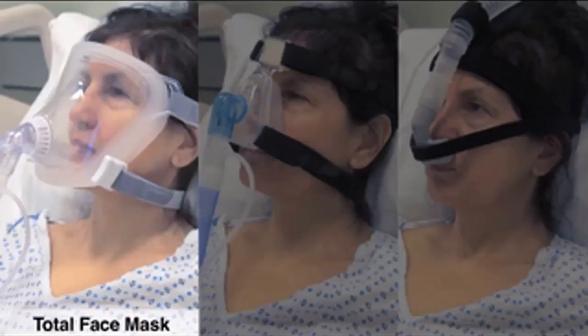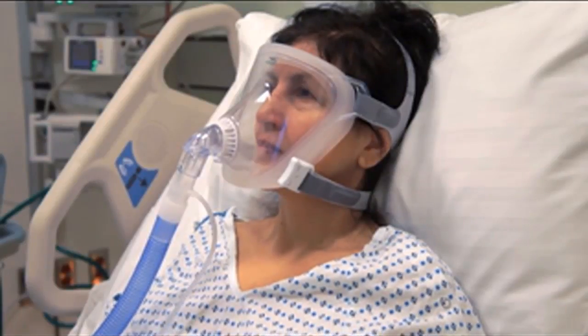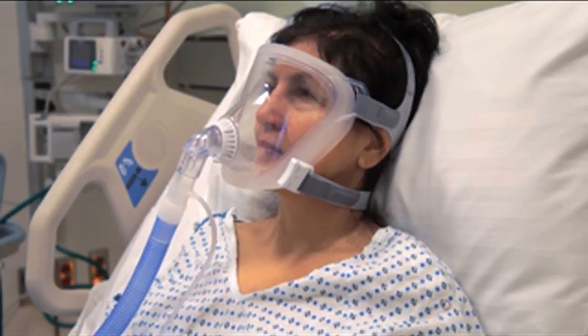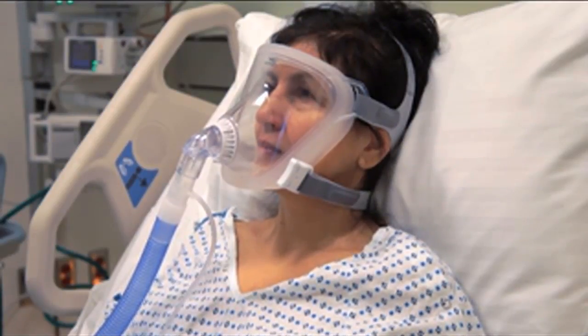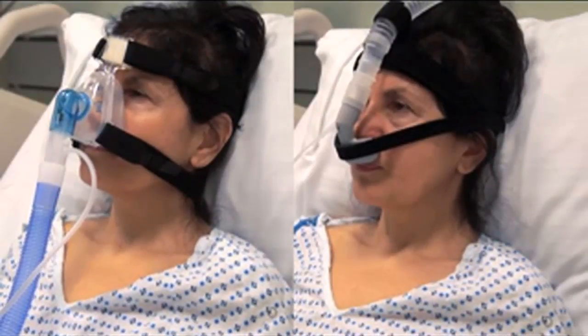Alternatives include total face masks, nasal masks, and nasal pillows. The total face mask encompasses the entire face, including the eyes. It does not abrade the nose, but some patients may find it claustrophobic. The nasal mask or nasal pillows generally cause less claustrophobia, but the mouth must remain closed to prevent air leak.